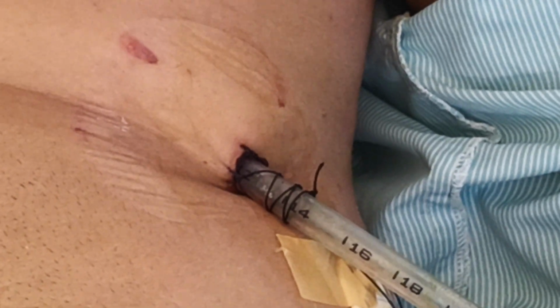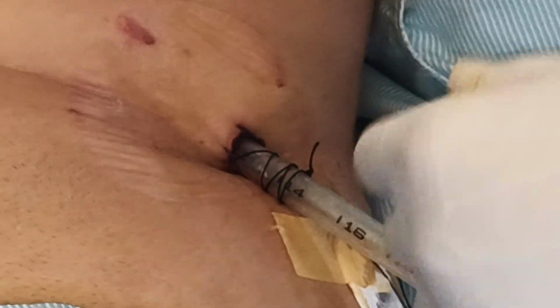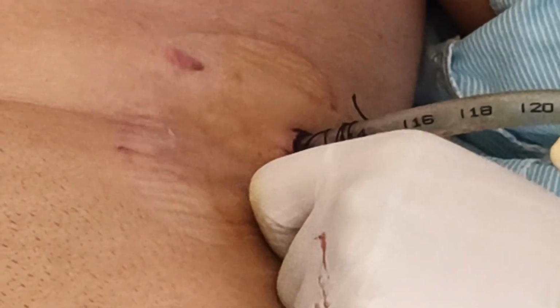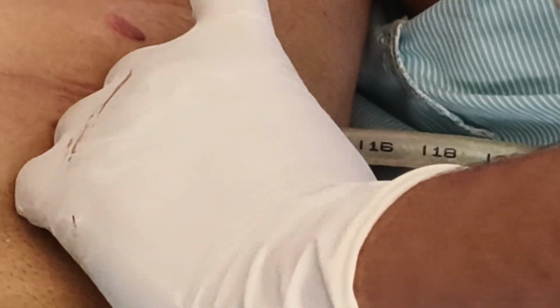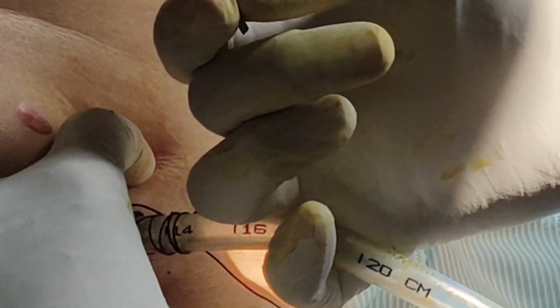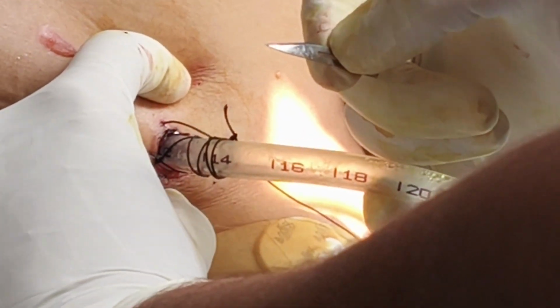So if you have not held the skin and the drain is very tight inside, and there is very big column movement, then if you just hitch and look somewhere else, in 2 seconds the drain can come out also. You understand that? So what you have to do initially, this is my technique, I don't know how others do, I just loop this thread around my finger, which will cause a bit of pain, and pinch the skin. After pinching, I have the drain here in my hand also, so that there is no chance that the drain will come out on its own. It's not only when you remove it; sometimes the drain can come out on its own also.